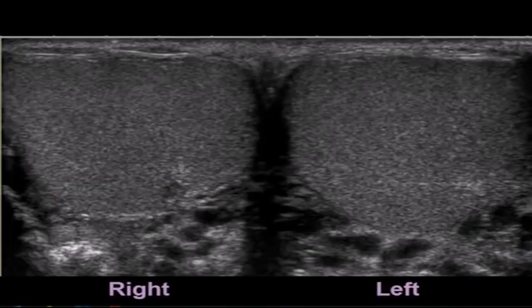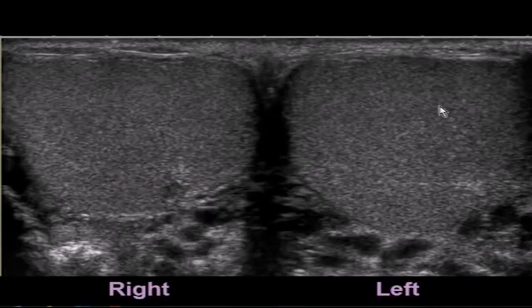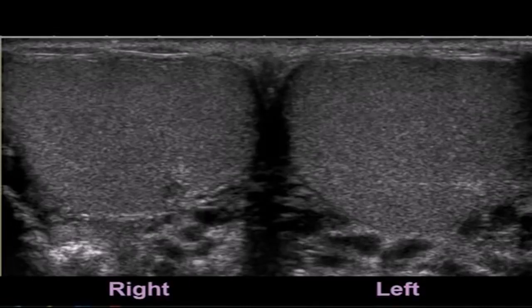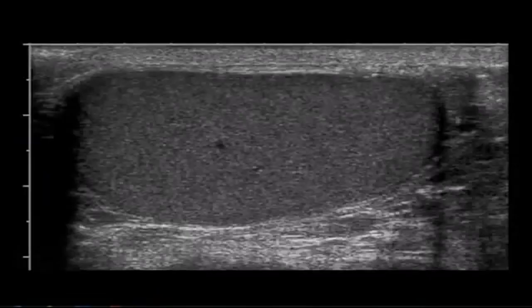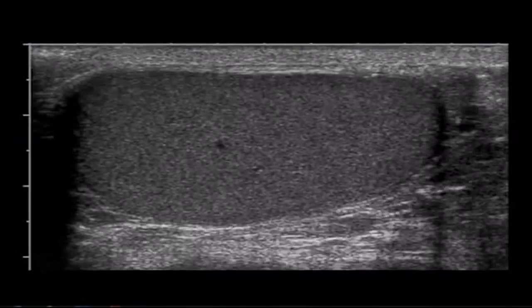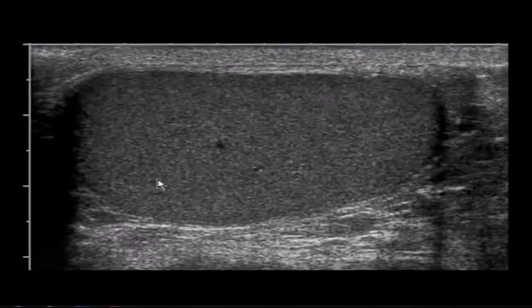This is a transverse view of the scrotum showing the right testicle adjacent to the left testicle. It's important when evaluating the scrotum to take an image showing the two testicles side by side for comparison of echogenicity and size, and then to take a longitudinal view of the testicle as well. This longitudinal view shows homogeneous echotexture throughout the testicular parenchyma.